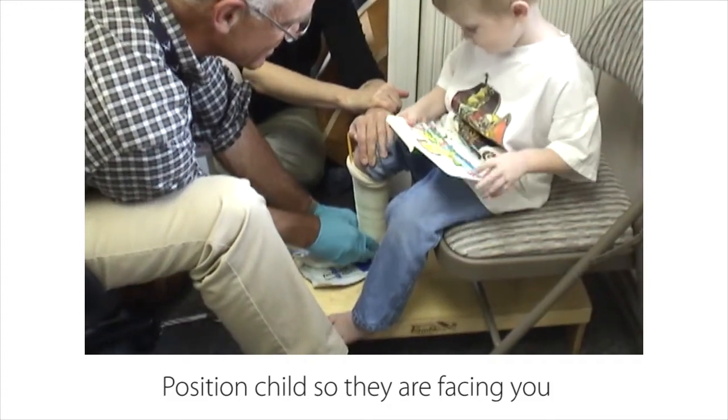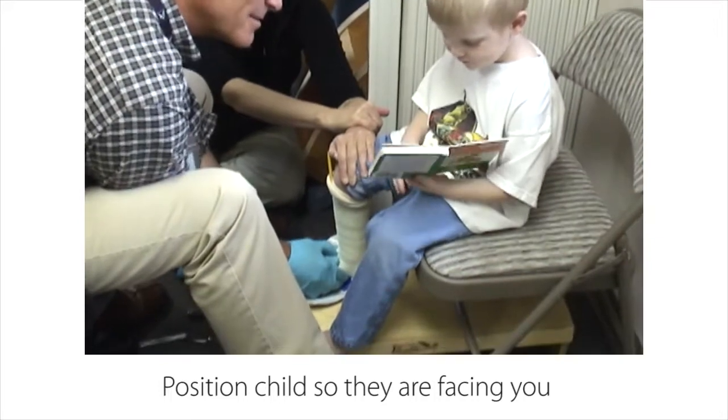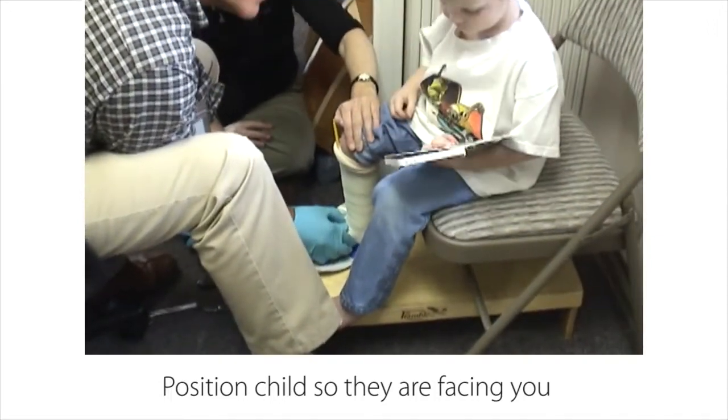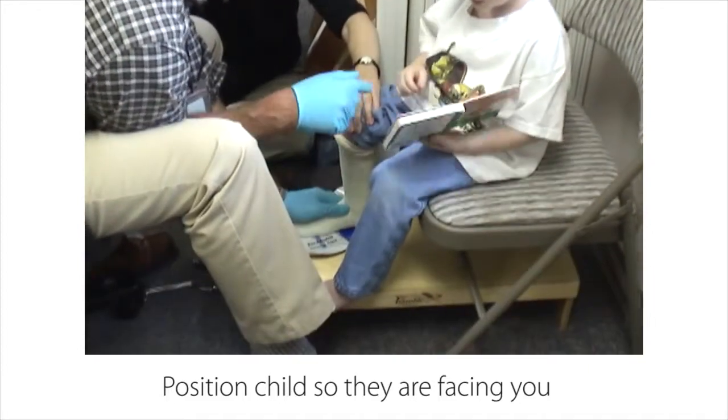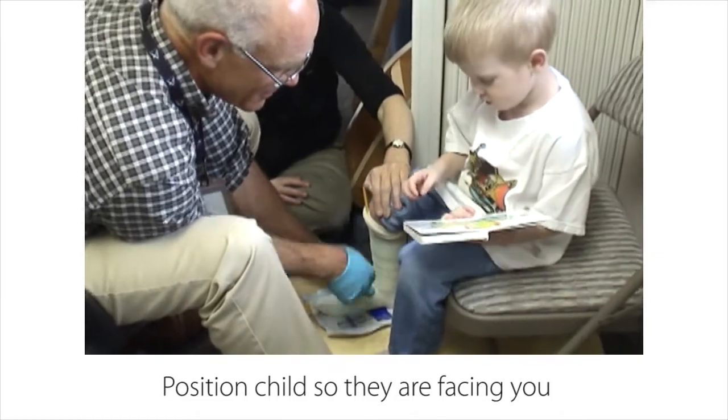Here are a few things you can do while casting to make the child feel secure and comfortable so they're more likely to cooperate. Arrange the seating so the child is facing you with their feet on a firm level surface. The casting process is not as frightening when the child can see what's going on and can participate in conversations.